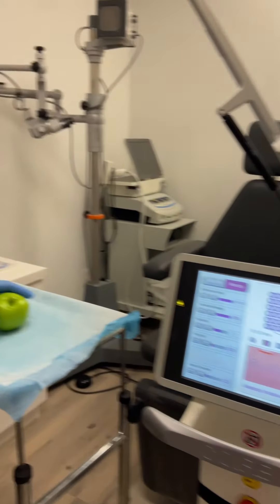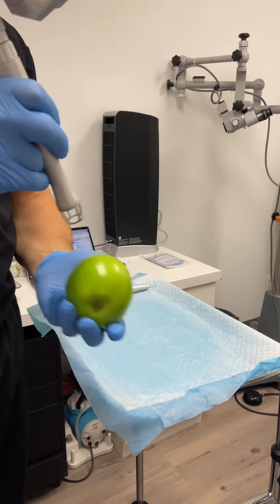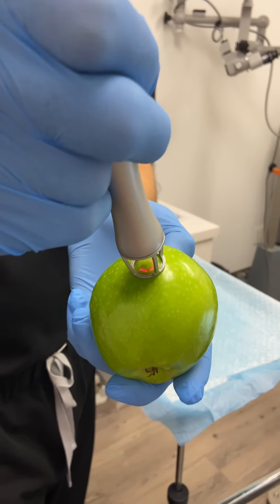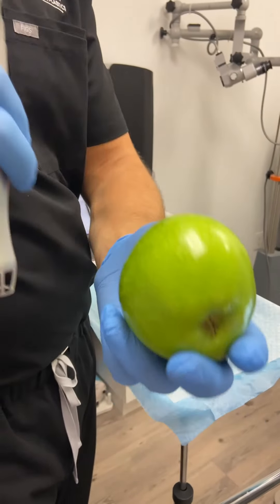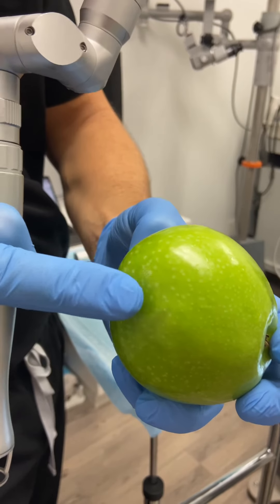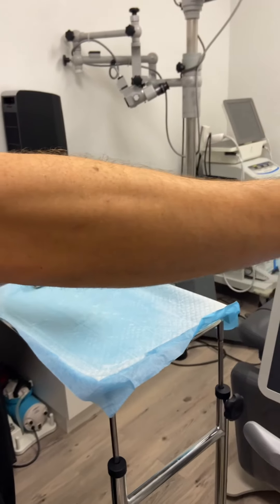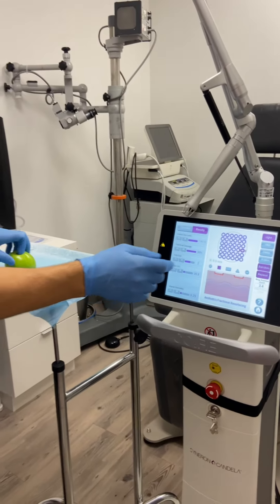Now that we have it ready, we have our patient here — my apple — and you can see the little red scanner. When I press on the pedal, it's done a very light resurfacing. The skin's still intact but we've removed a little bit. That's the lightest mode this laser goes on, and I'll be honest, I basically never use it.